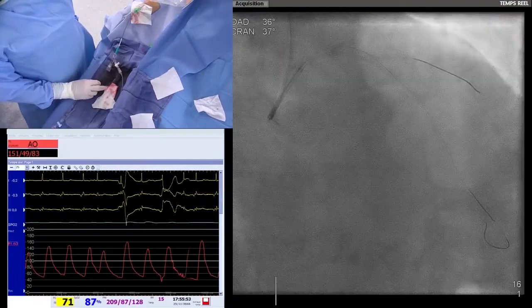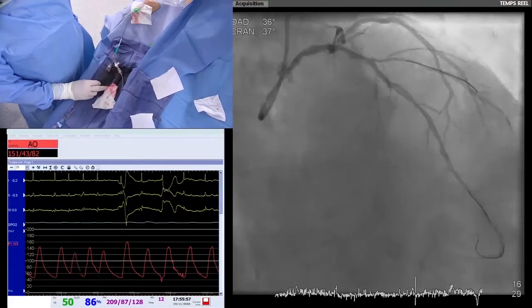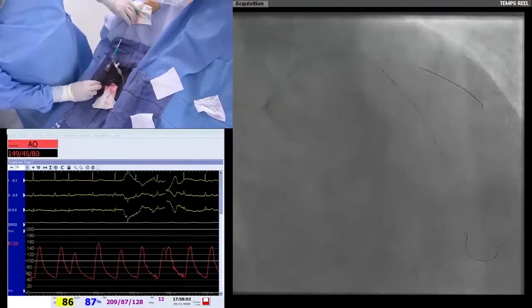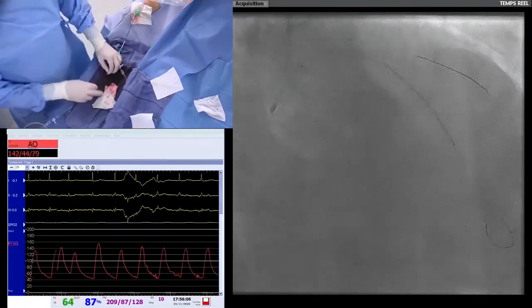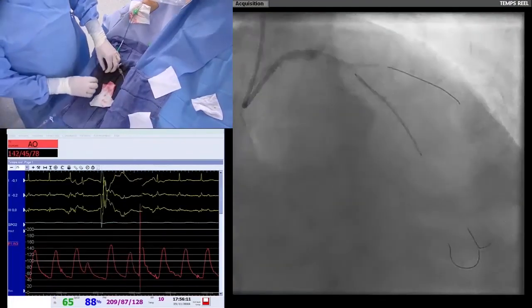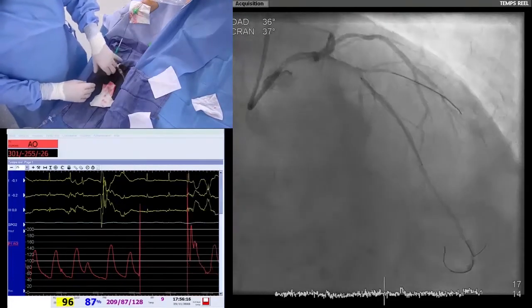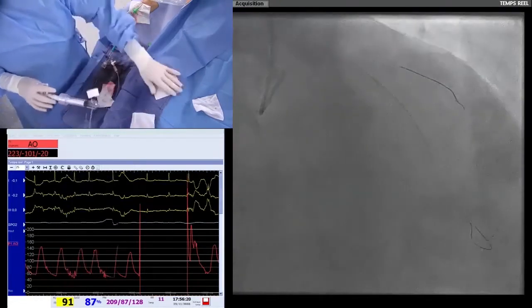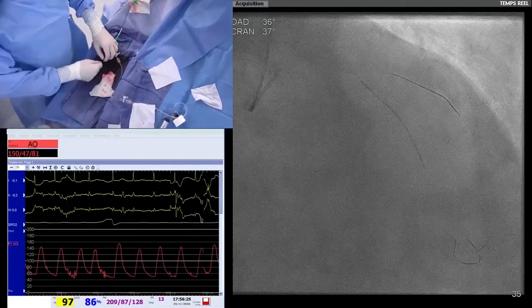Sorry, I just want to check in the angio if I have to cover the bifurcation. Or maybe we have to do another angio. I think we will have to use 2 long stents. So the pressure is good. Okay. Injection. Oh, I think it's good at this part. Yeah, I would like to avoid covering the diagonal with 2 layers of strut. I think it's okay. So now it's time to remove the rota wire.